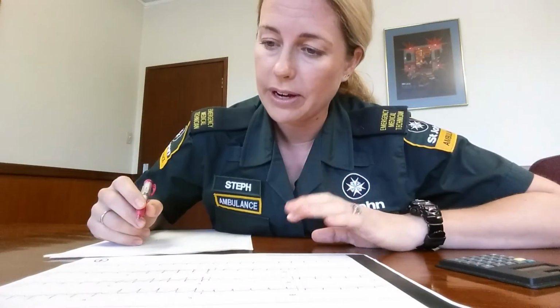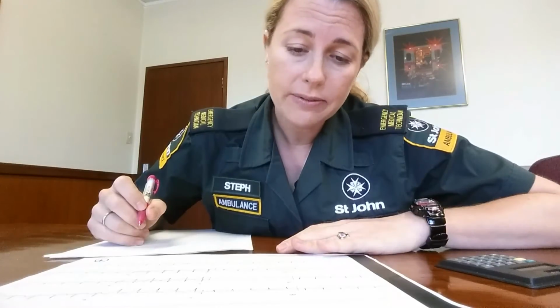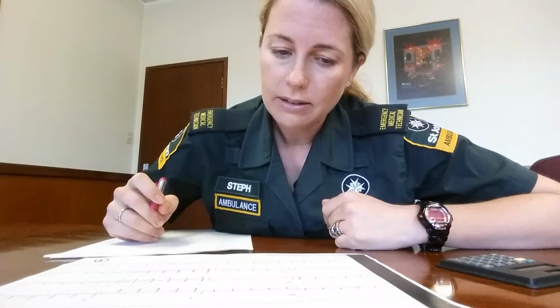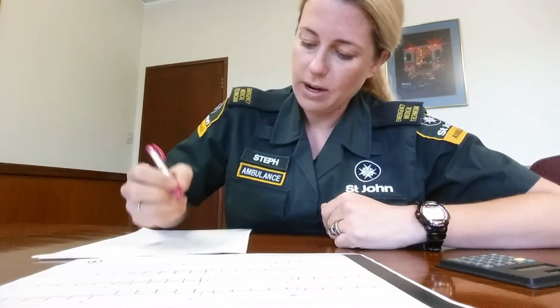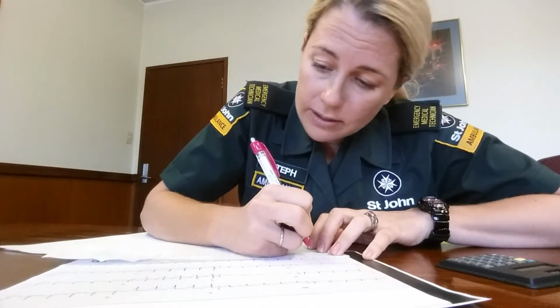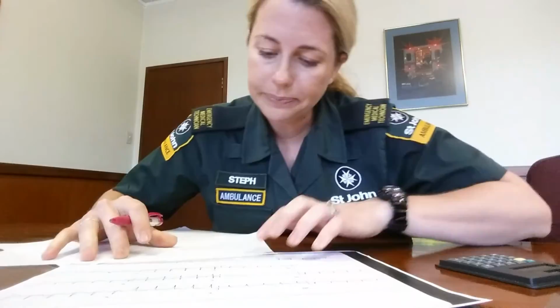So I've got no name, no date, no how the patient was feeling or anything written on there. There doesn't look to be much artifact. I've got a negative AVR, which tells me that the leads should be in the correct position. Right. I'll go for the rate now. Let's see if it is regular. And I've got a QRS in every lead, so that is good as well.